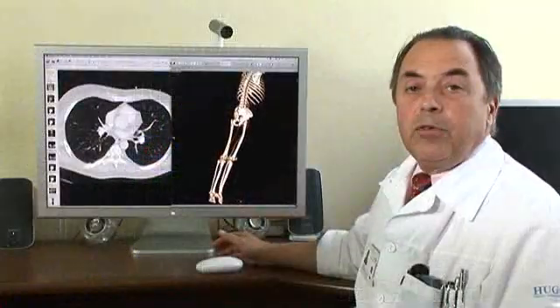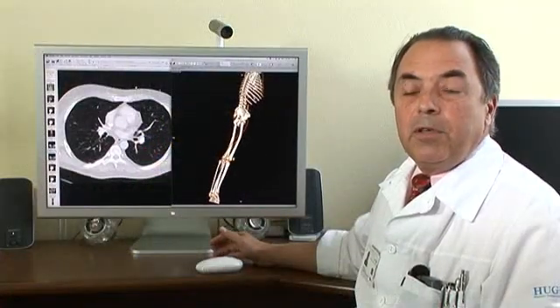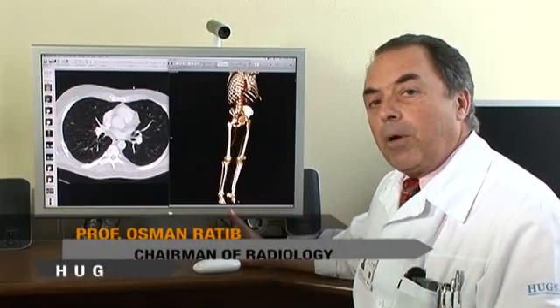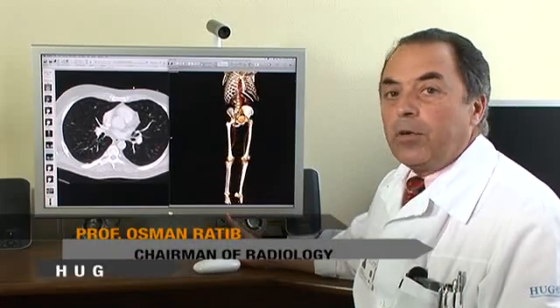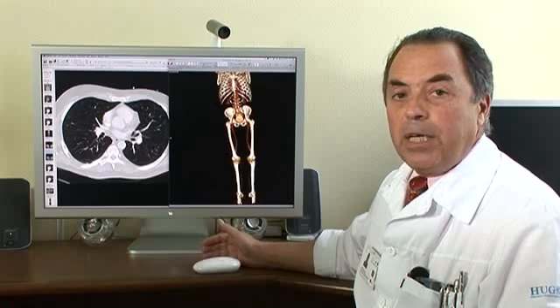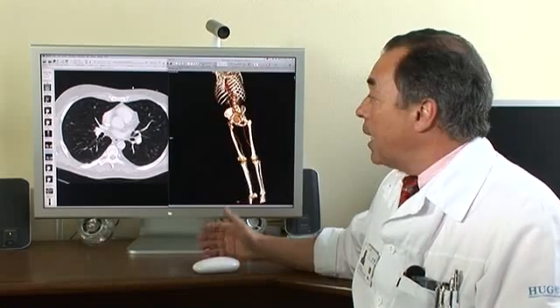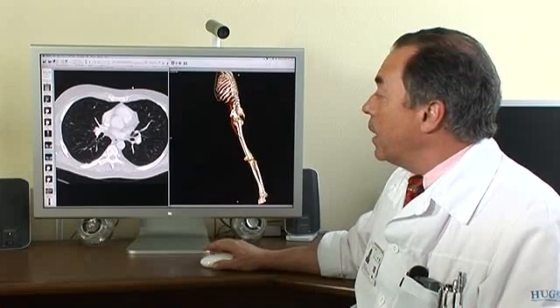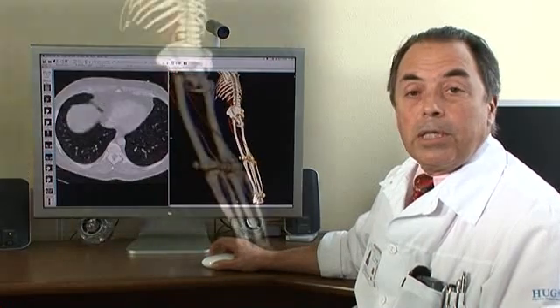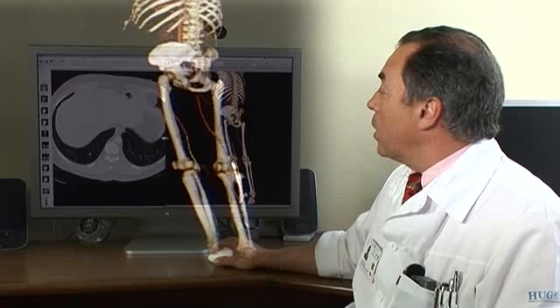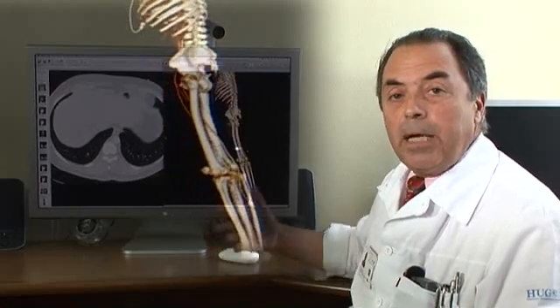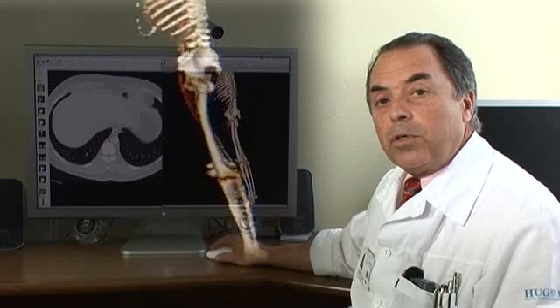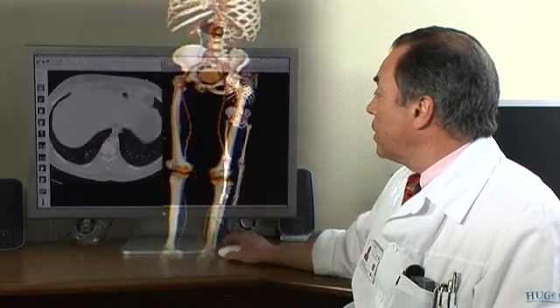The software is essentially a review and visualization tool that can handle any type of images, whether MRI, CT, or any conventional imaging as well. It allows the user not only to browse through regular images like you would with a regular workstation, but also to do a lot of 3D rendering and multi-dimensional rendering tools that are particularly useful for surgeons and for orthopedic surgeons in particular.